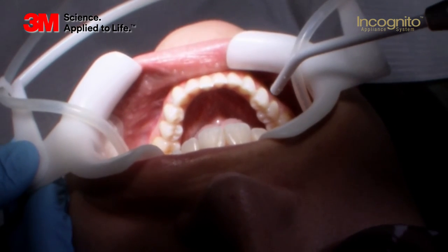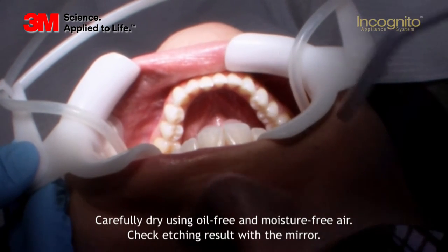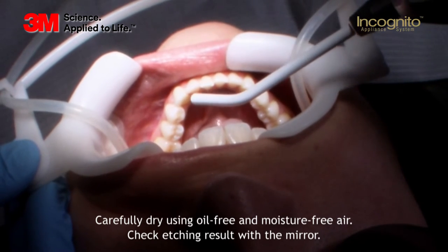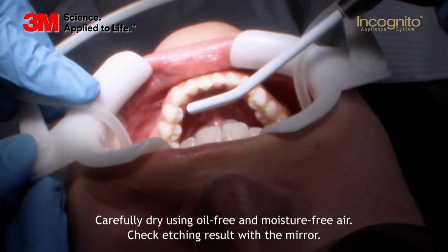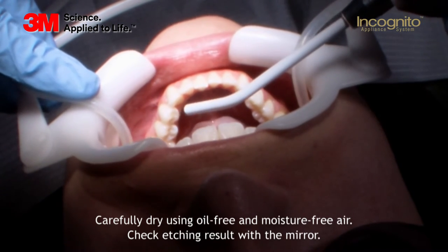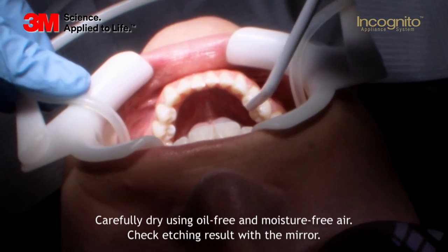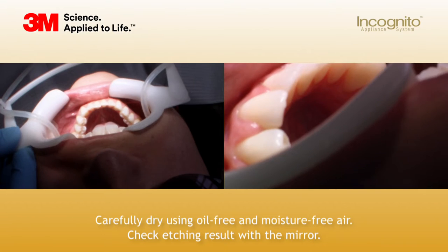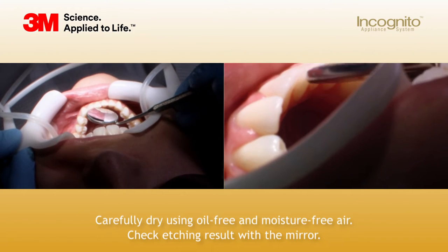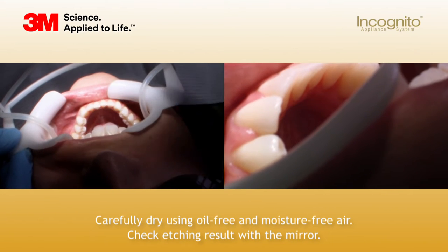After rinsing with water, you have to dry the surfaces. I always start on the buccal side to make sure all the saliva disappears, and then you will dry the lingual surfaces. Having done so, you have to make sure that you see a clear white etching pattern. When you verify all the surfaces have been etched properly, it's time to put the bonding on the tray.